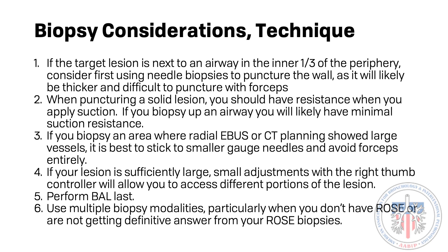Bronchoalveolar lavage can also be accomplished through the Monarch robot. Detach the luer lock suction from the scope and attach a 30 or 60 milliliter luer lock syringe with sterile saline. Flush the saline into the scope and then apply suction while slowly withdrawing the scope. Keep in mind that very little lavage fluid tends to return. To minimize radiographic changes, you should always perform bronchoalveolar lavage last.